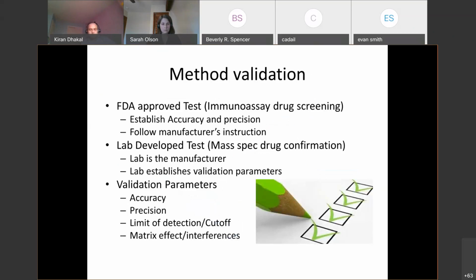So method validation is an important part of drug testing, because during this process we characterize all these errors, and then we can say that our measurement system may have this many errors. Our error margin is this. Our confidence is this.